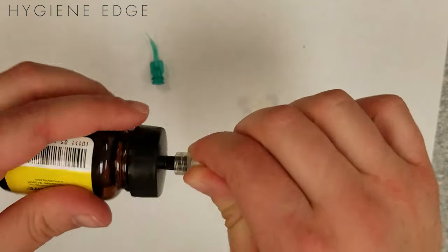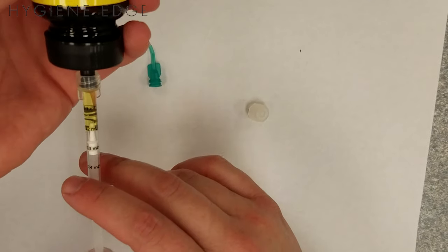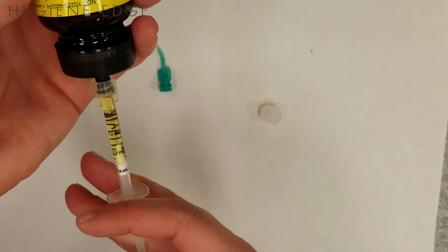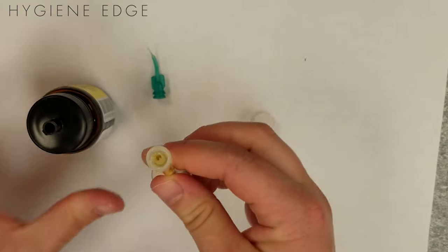To load this, just twist the syringe into the port, invert the bottle, and then slowly draw the liquid in. If air gets in, you can push the liquid back in and then redraw it. 0.4 is the maximum dose, but luckily a little bit goes a long way with this. Tip the bottle back over, then remove the syringe and place the tip onto the syringe.